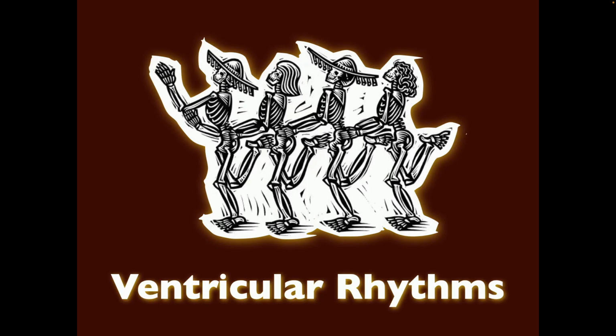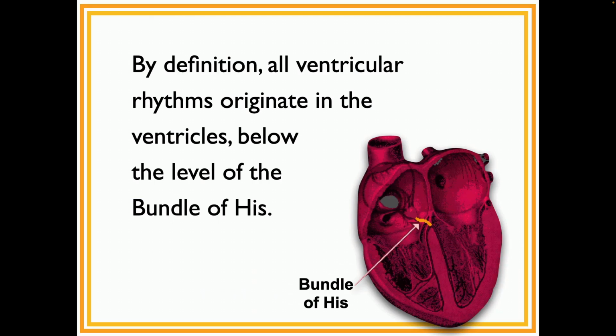Okay, Chris, where do ventricular rhythms originate? In the atriums. Okay, so by definition, all ventricular rhythms originate in the ventricles below the level of the bundle of His. So the bundle of His is that little strip that comes out of the AV node, and then we're officially in the ventricles.